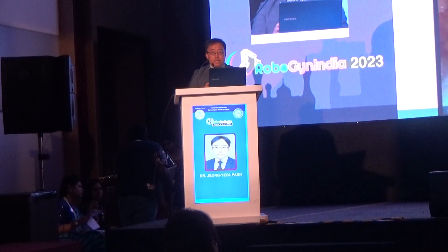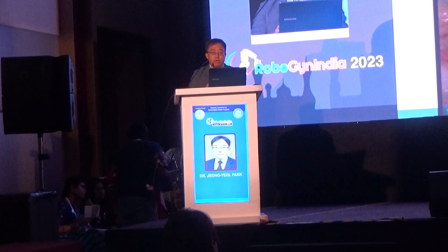I cut the omentum using a handheld energy device. This is very fast, so these days I prefer this approach.